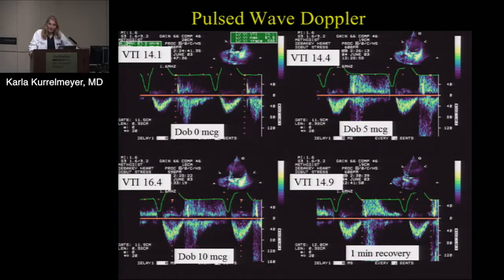And you stop when that peak velocity across that continuous wave jet is more than 4. There's no reason to go above 4 because you've already answered the question. So once it's at 4, you stop. So in this particular case, that was at 10 mics and we stopped.